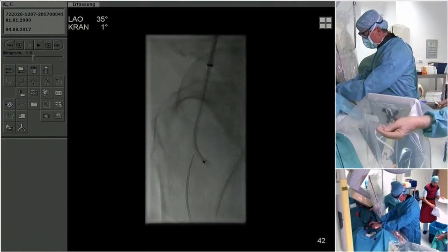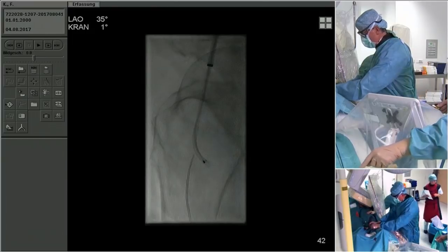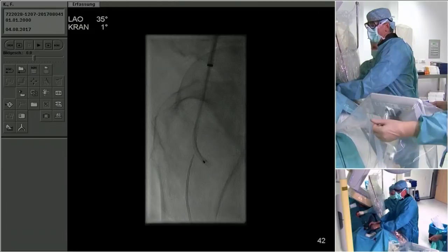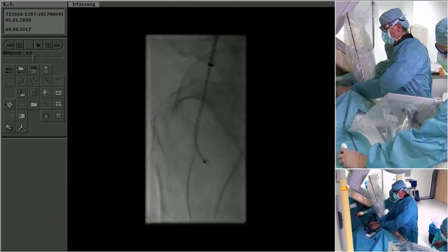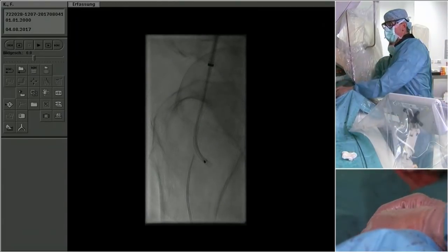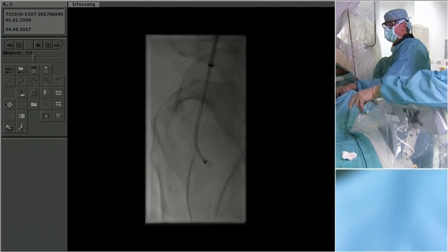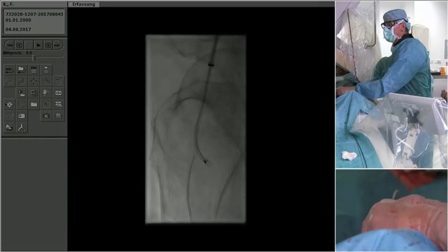Andrej, when you leave the needle, does it stay in position? It looks like it does. Does it not sometimes spin away? It does sometimes spin away. So before I actually try to drill here, I would probably check once again the different angulations. But let's say it's semi-stable.